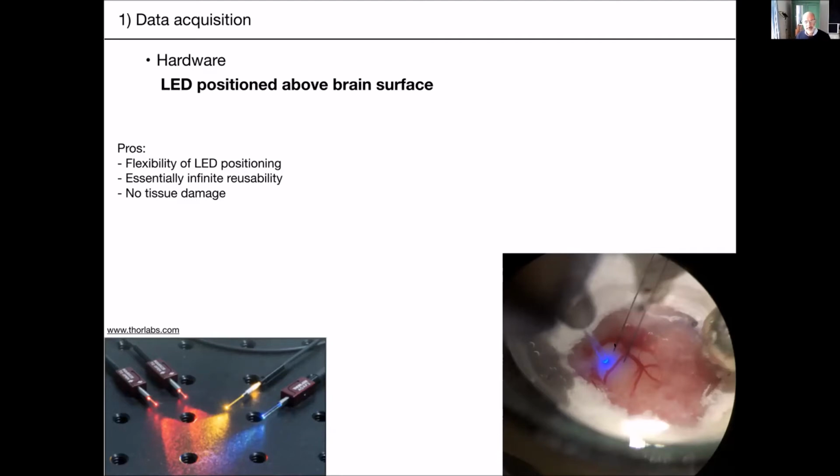Yeah, you might break probes doing that, by the way, so be careful. The reason why we do this is so that the craniotomy gets less crowded, because as you can see here, you don't really see it well, but this is in a saline bath, and on the side you have a silver wire ball which is going to the ground and the reference, and on the left here you have your LED attached on another manipulator. The more things you can put on a single manipulator, the better, because craniotomies are small. So steric problems during your experiments are a thing you need to think about when you decide upon what kind of light delivery device you want to use.